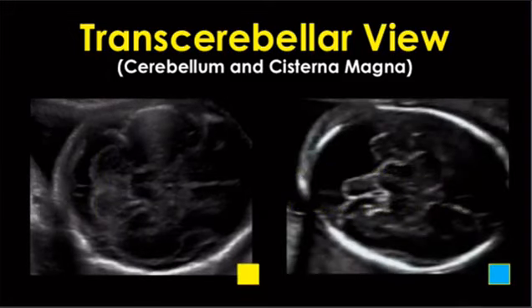All right, so let's take a look at this versus that, between the normal cerebellum and what's not normal. Remember, I mentioned that this cerebellar contour here is really important. It's sort of like a dumbbell, with a weight on one end and a weight on the other end, and the little rod that you hold on to is in the middle.